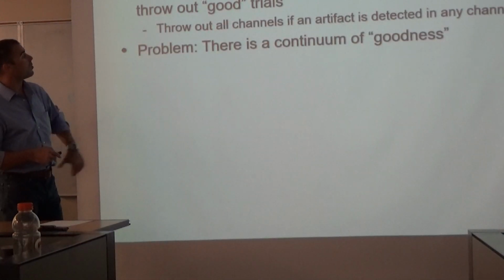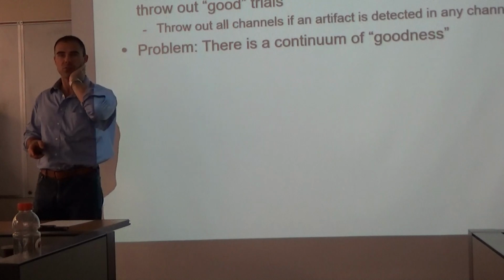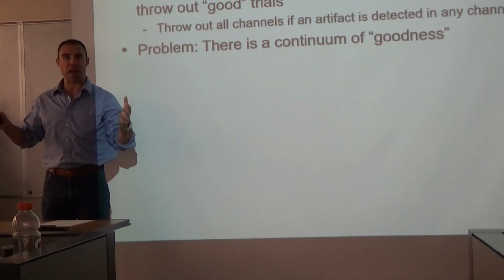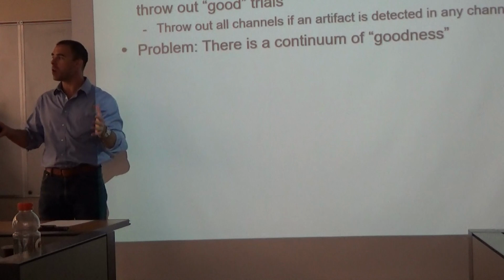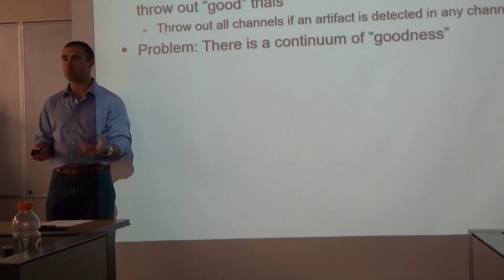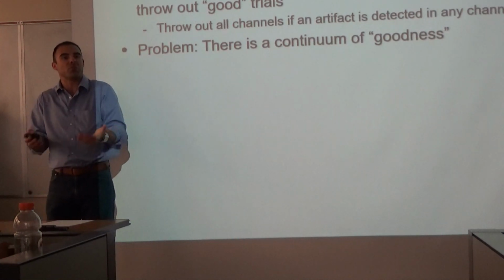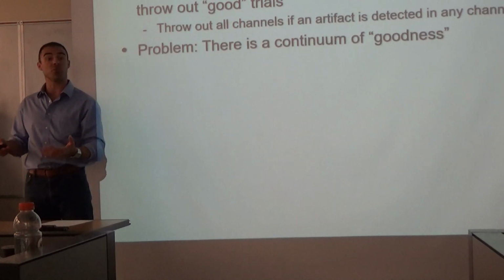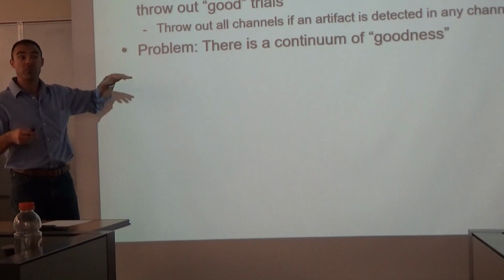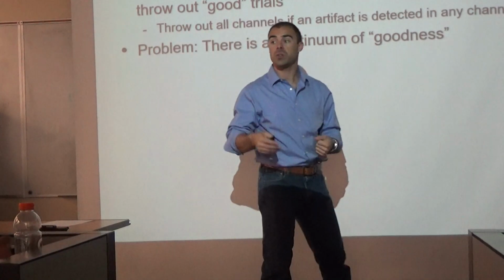And so the trick here, when we're talking about artifact rejection, okay? Remember last class we talked about throwing the baby out with the bathwater? Right? You have this problem. You've got bad stuff in the data. You've got these artifacts there. Because all we care about, as psychologists in this situation, is the brain. We don't care about muscle activity. We care about the brain activity that we're measuring. Anything else besides the brain activity is stuff we don't want to know about, or at least we don't need to. And in fact, things that might interfere with the signals that we do want. So we have this problem that within all the good data that we have, we also have a mix-in of bad. And we have to do that proverbial sifting of the signal from the noise, the wheat from the chaff.